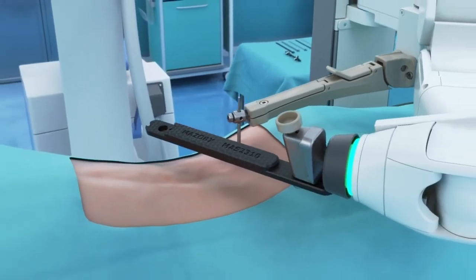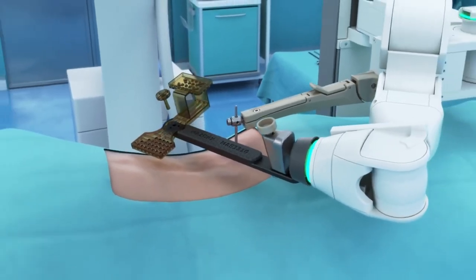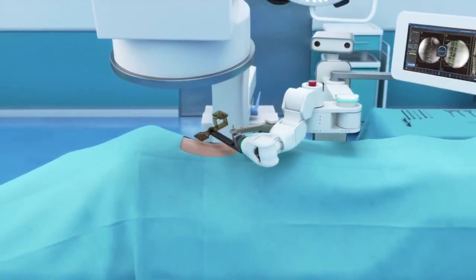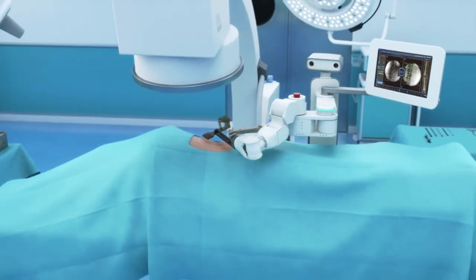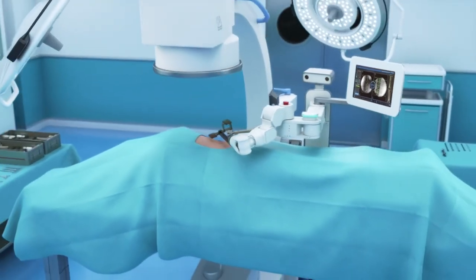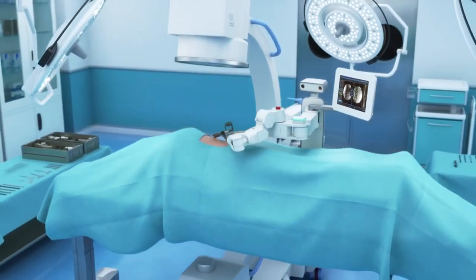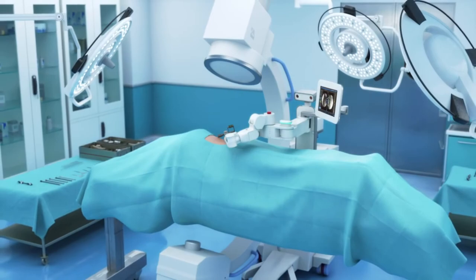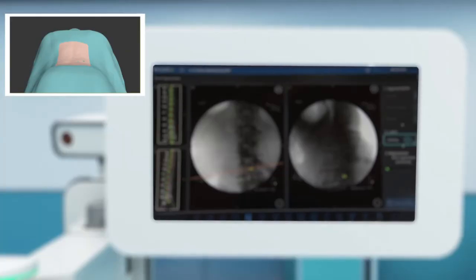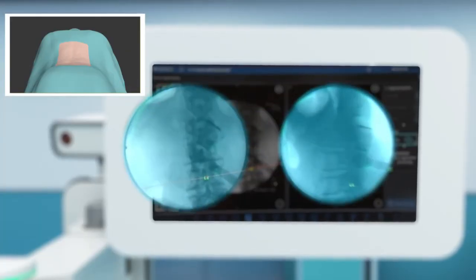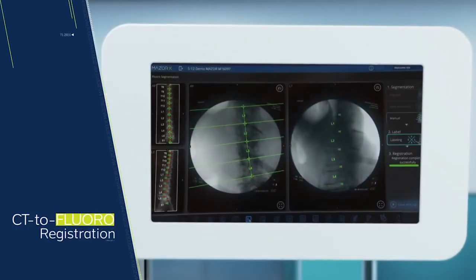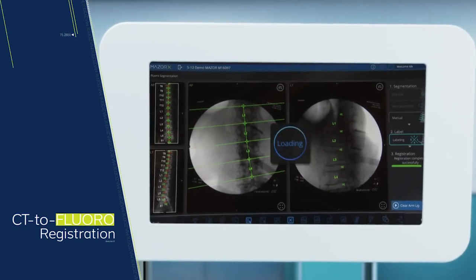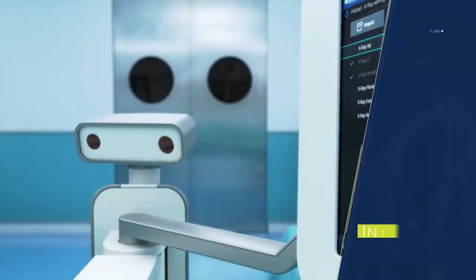Next, two fluoroscopic images are taken with a 3D marker to match the pre-op surgical plan with the intra-op anatomy. Each vertebral body is registered independently with its own distinct accuracy using MZOR's proprietary CT to fluoro registration process.